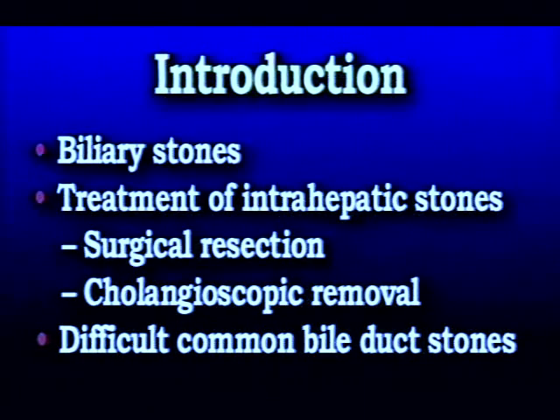Stones can be developed at any site of the biliary tree. Among the biliary stones, intrahepatic stones may be the most difficult one to control. In case of stones localized in either the right or left intrahepatic duct, surgical resection can be a good treatment modality.